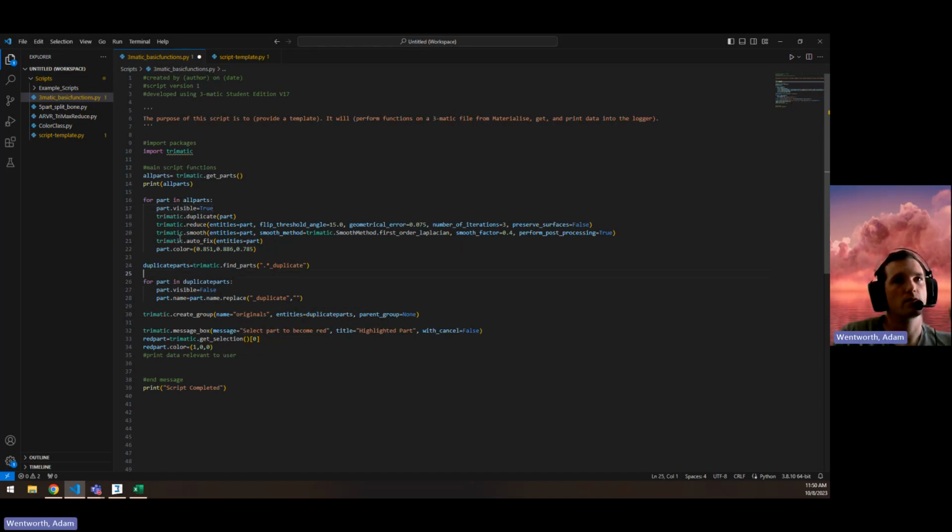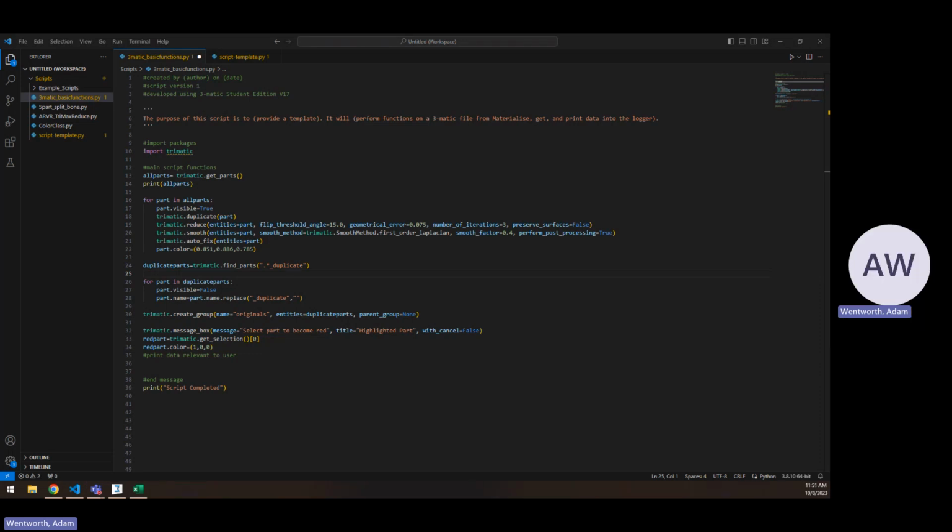Then we're creating another list. Since we've duplicated these parts, we're finding that list of duplicates by finding all the parts that have underscore duplicate in their name. So that returns our list of duplicate parts. And then we're writing a for loop to do something with all of those separately. So one is hiding them. Two is getting rid of the underscore duplicate in the name. So we're doing that with a part.name equals part.name.replace. This is just a regular Python function for replacing some string text. Then we're creating a group and we're putting all of those parts in the list in that group.